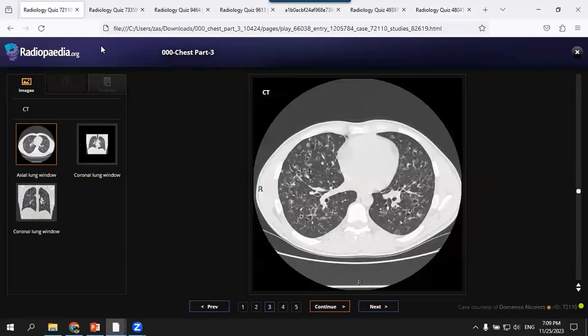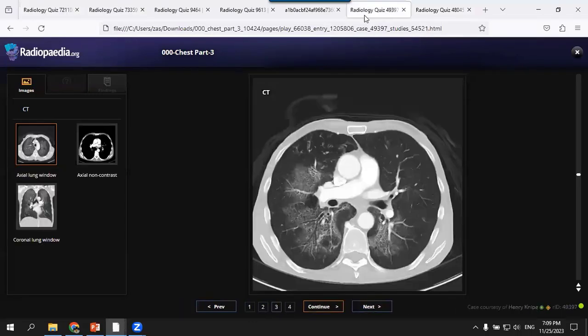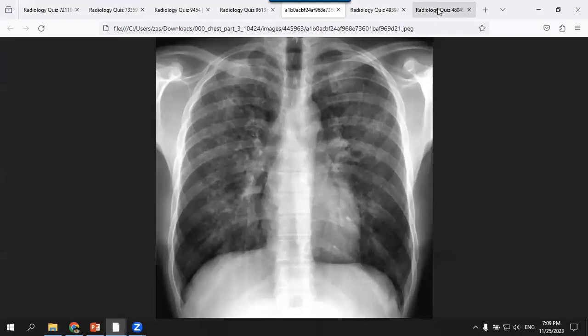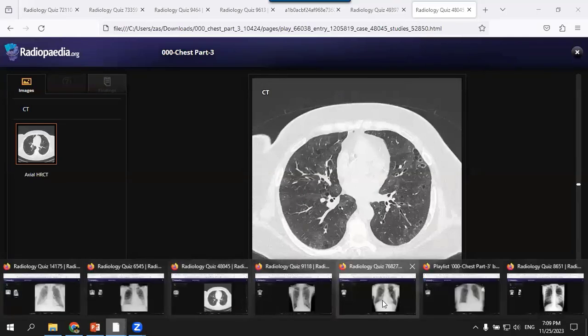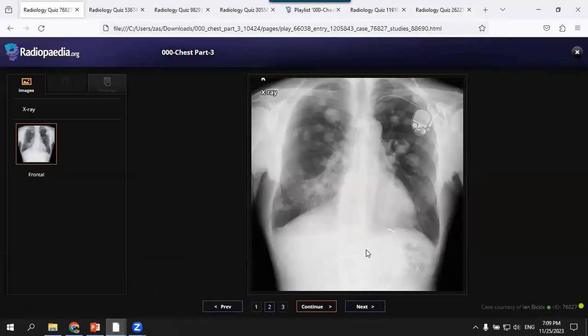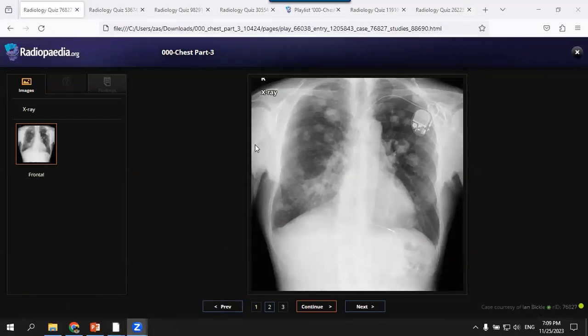These are the common cystic patterns we may encounter in the exam setting: Langerhans cell histiocytosis, LAM and pneumocystis pneumonia, and the least likely types, lymphocytic interstitial pneumonia or desquamative. Very good. Thank you. Okay, I think we have now covered some nodular pattern or micronodular pattern, and cystic pattern that may mimic reticular pattern. Now some other lesions also for a differential.